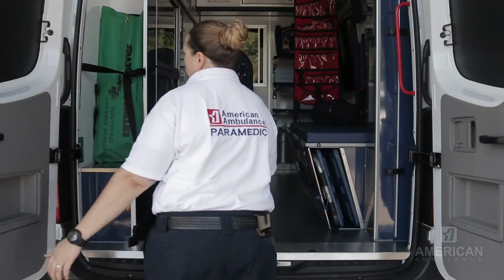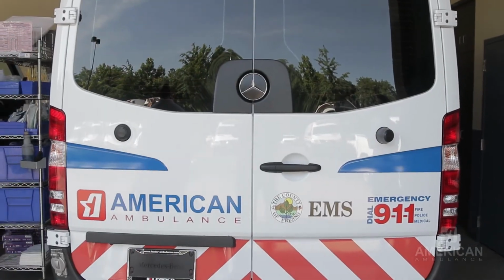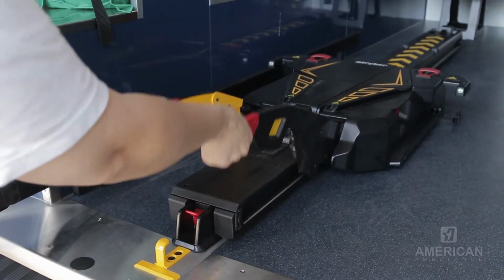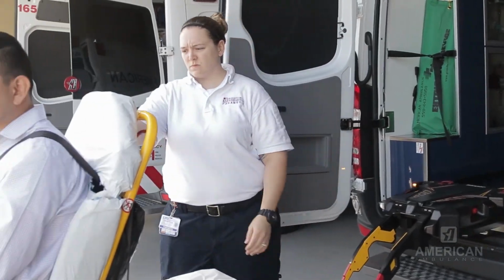Once the glide system is back inside the ambulance, we can go ahead and close the doors and then move our patient and our gear to where they need to go. When we're ready to load the patient back up, first thing we're going to do is lift up on the loading arms and move the glide system back into the proper loading position outside of the ambulance.